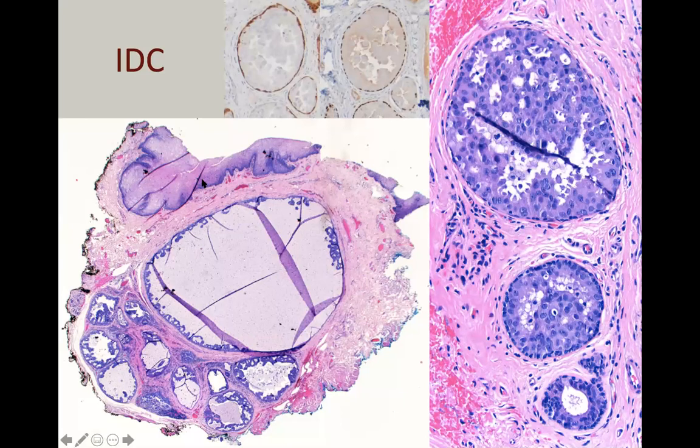You can see here a minor salivary gland site with overlying squamous mucosa. You can see this glandular cystic proliferation in the bottom, but every single one of these cysts is lined at the periphery by a layer of myoepithelial cells with SMA staining and with P63 staining, and the tumor is proliferating only within the lumen of these ducts. This retention of the myoepithelial cell layer is thought not to be a component of the neoplasm, but the residual myoepithelial cell layer of the normal ductal system.